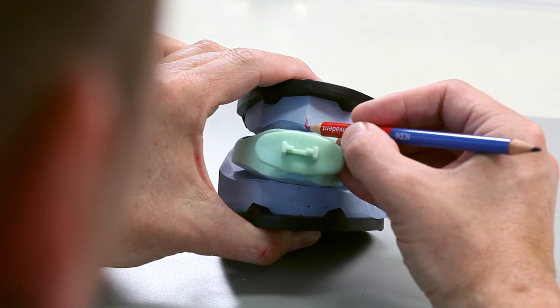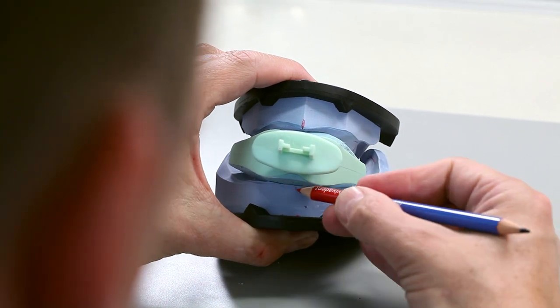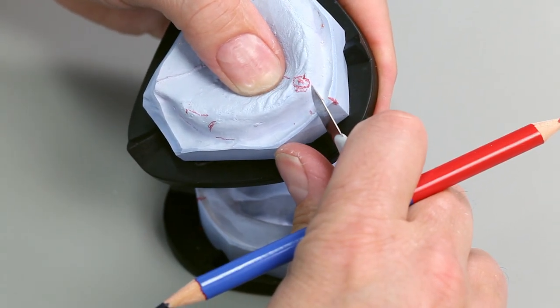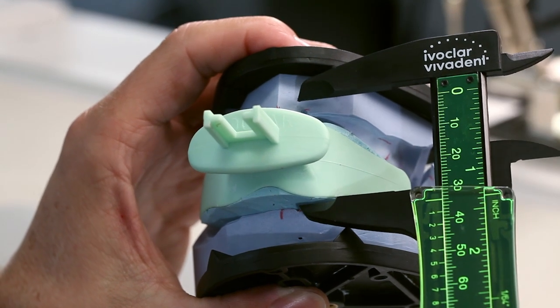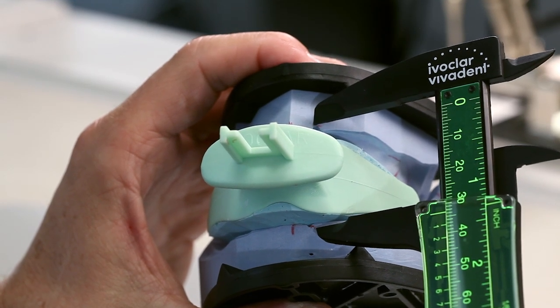Mark the extended anatomical midline in the upper jaw on the model edge and transfer it to the lower jaw. Mark the lowest point in the vestibule and trim the model edge up until this point. The relation of the jaw models obtained with the centric tray corresponds roughly with the subsequent vertical dimensions within which the occlusion is built up or reconstructed.